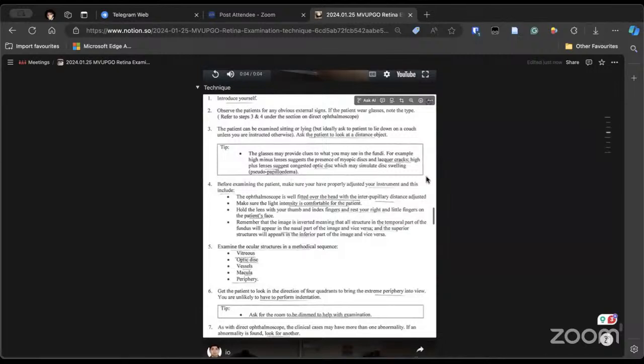In the examination it might not be possible because the time is less, but if you have been practicing this, it will come naturally. But definitely darken the room. That is very important. Darken the room. And you have to adjust the instrument. You have to ensure that the instrument is working properly.